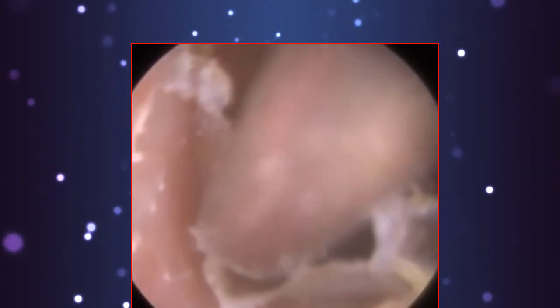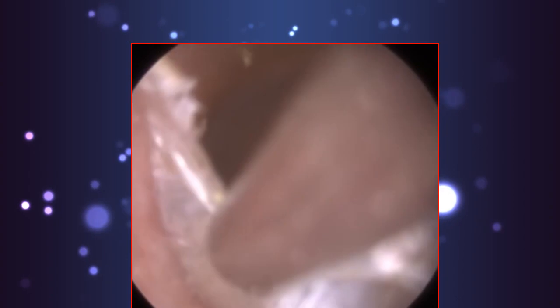So we're just at the base of the ear canal here and anteriorly. You can see we're just going to bring this skin together and then peel it. I'd compare it to when you've got some sticky tape, sellotape, on an envelope or a piece of paper or some cardboard, and you're trying to remove this sticky tape by gently peeling it without damaging the envelope or the piece of paper or the cardboard outer layer. And that's what we're doing.